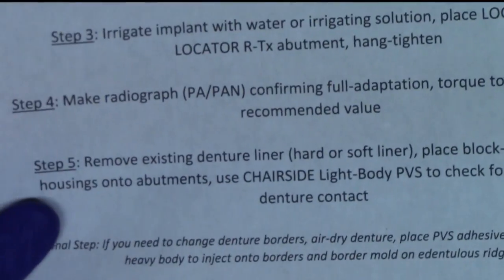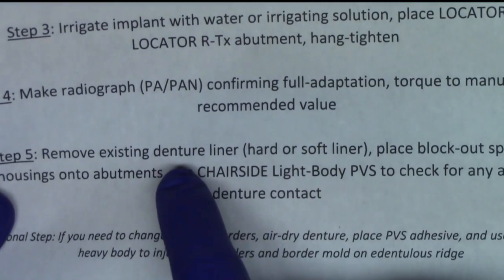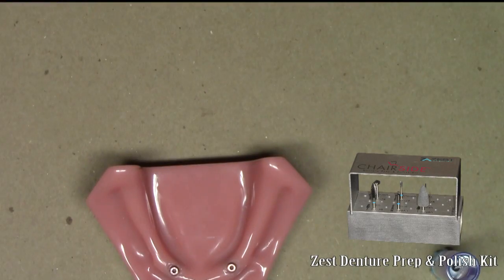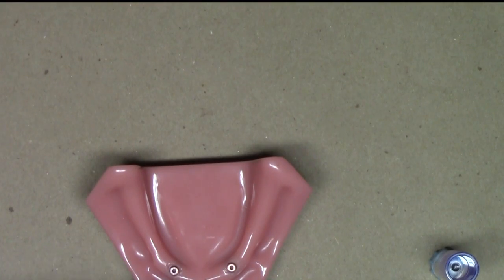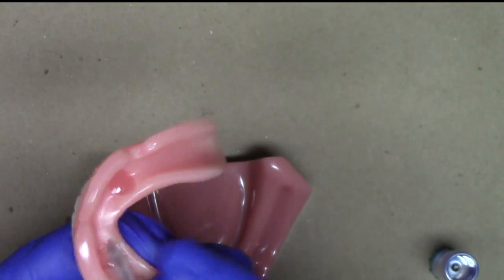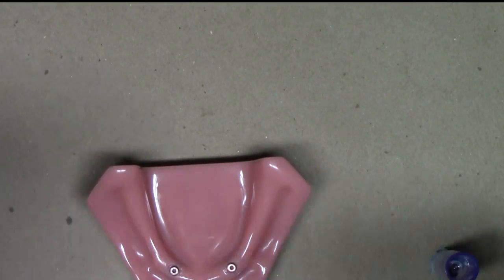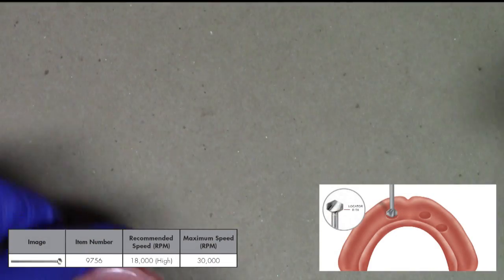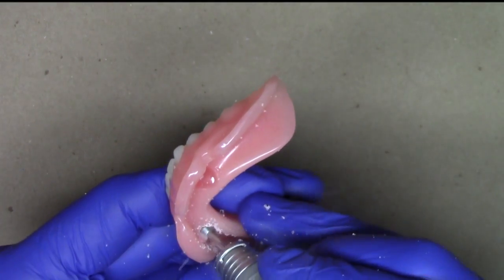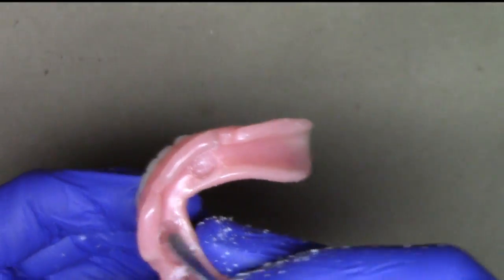Now we're ready to start the conversion of the reline procedure. What I like to do is remove the existing denture liner, either the hard or the soft liner. To do that, I use my chairside prep and polish kit, or a hand instrument such as a spatula, just to pop out the soft liner. As you can see, the chairside soft liner is in there pretty good, so I'm going to use my locator recess spur. Now that I've used my locator recess spur to remove most of the soft liner, I'm just going to take a hand instrument to clean it up a little bit more.